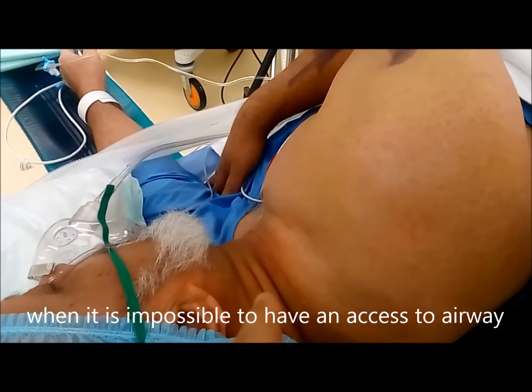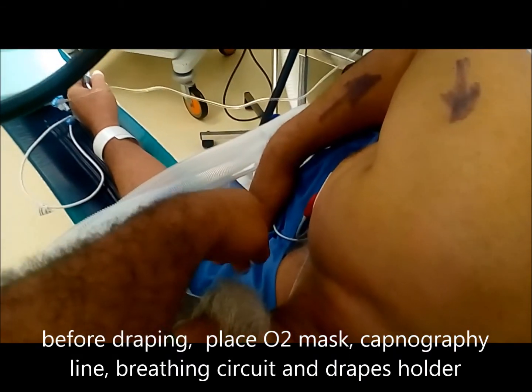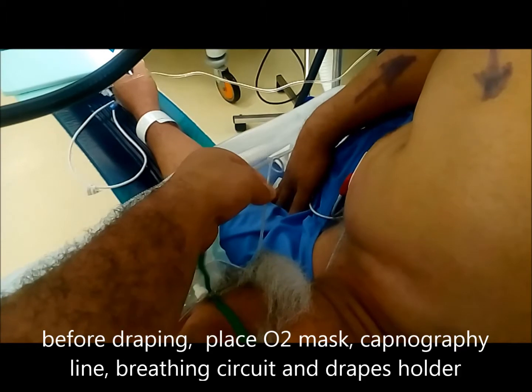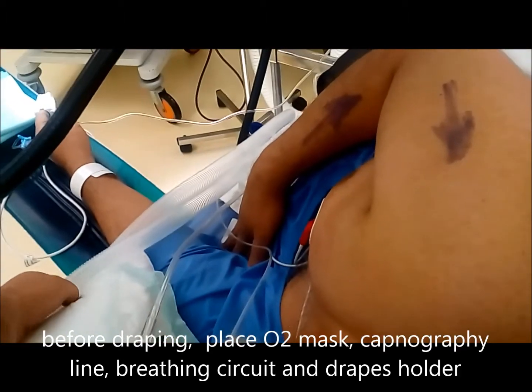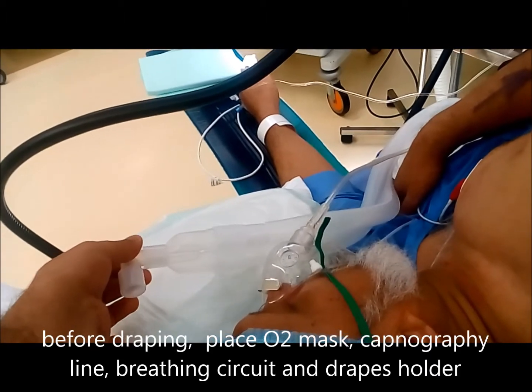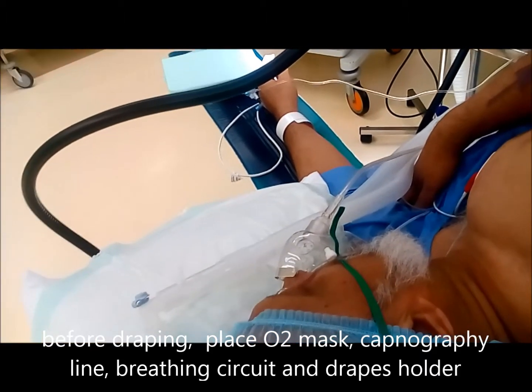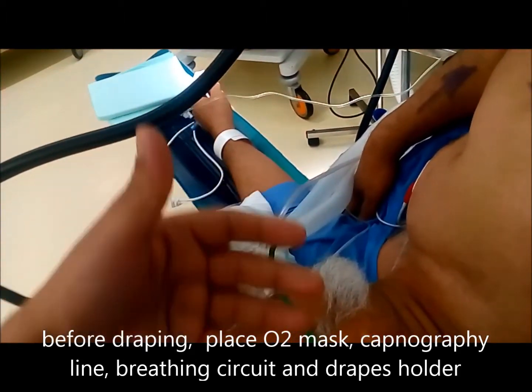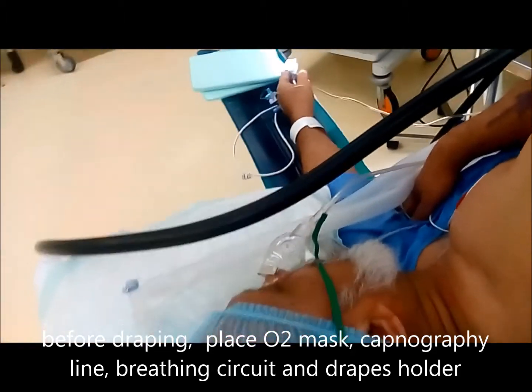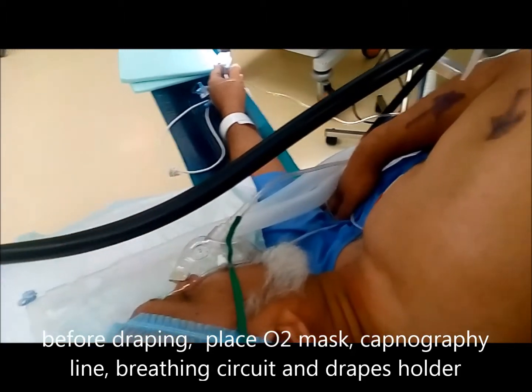After the patient receives a scalene block, we must take care of oxygenation. This is the equipment cabinet so we can monitor the patient's breathing during surgery. As backup, we place the general anesthesia circuit here — if you want to give general anesthesia at any moment, you can go down below the drapes and insert it. This setup also helps manage claustrophobia, ensuring nothing is pressing directly on the patient's head.